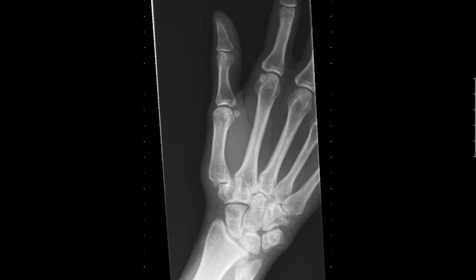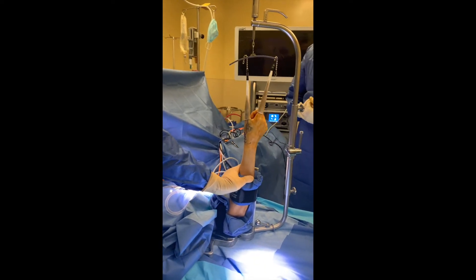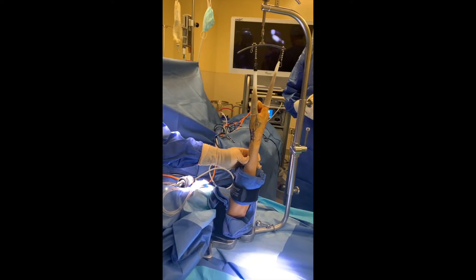This patient wanted to avoid standard arthroplasty procedures for CMC joint arthritis and elected to proceed with arthroscopic, minimally invasive management of her thumb arthritis. The setup involved use of the Arc Medical Traction Tower, and 10 pounds of traction are placed across the thumb CMC joint.